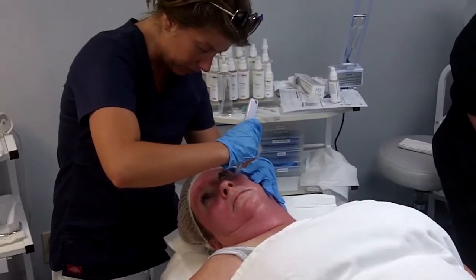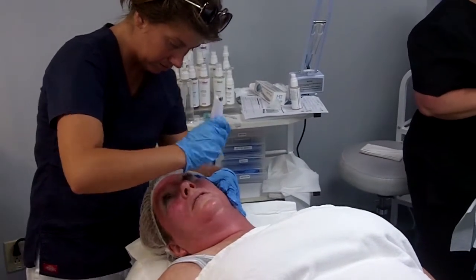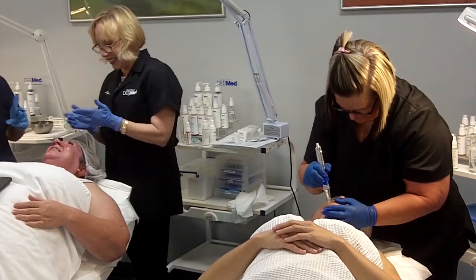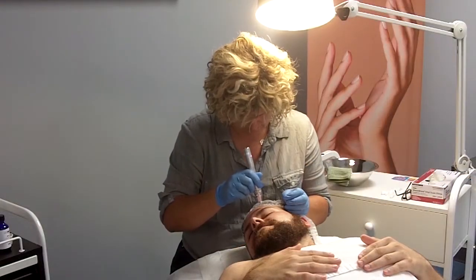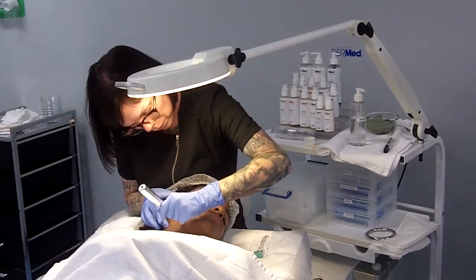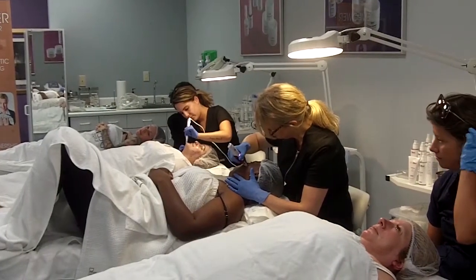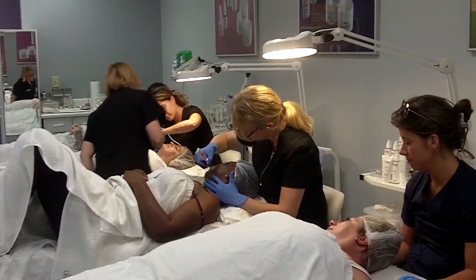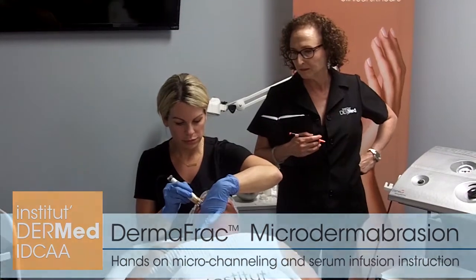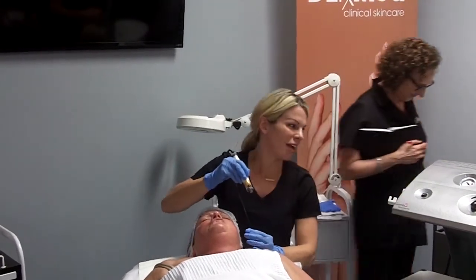What technique would you use on that? The one that you feel the most comfortable with, given the amount of space you have. She's a professional. So, brighter roll. How's that pen feel? Does that feel okay? We can turn it down just a tad. Match the other side the same. All right, turn it up.